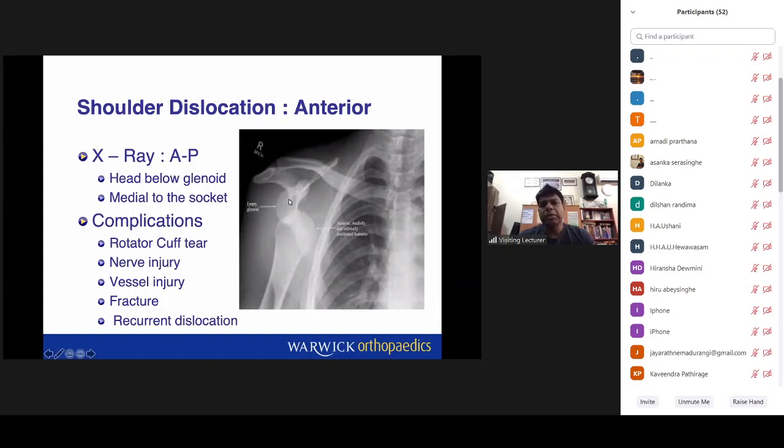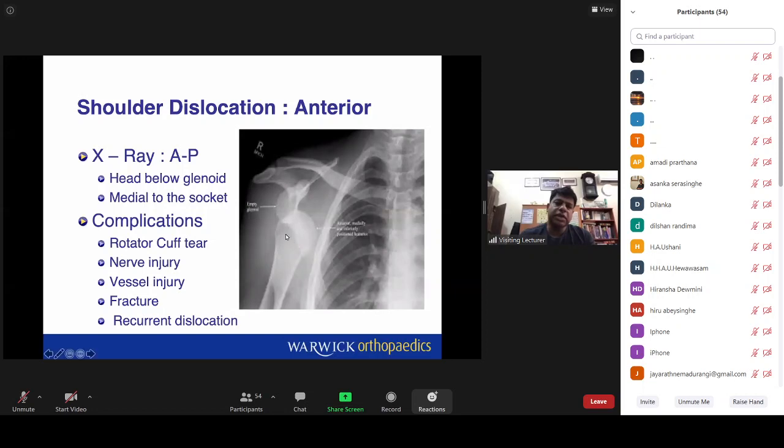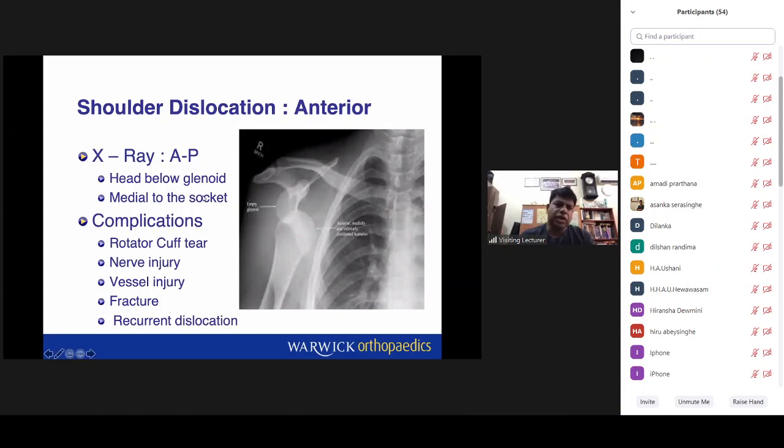Now, always remember that in anterior dislocation, the humeral head is inferior to the glenoid. There's no inferior dislocation as such. If you take a lateral, you see this is anterior, but it's also inferior to the glenoid. This is a classic anterior dislocation. Complications are classically rotator cuff tears and nerve injuries. Recurrent dislocation is common because when rotator cuff injuries occur, the shoulder can go into recurrent dislocation. We need various stabilization procedures for that.